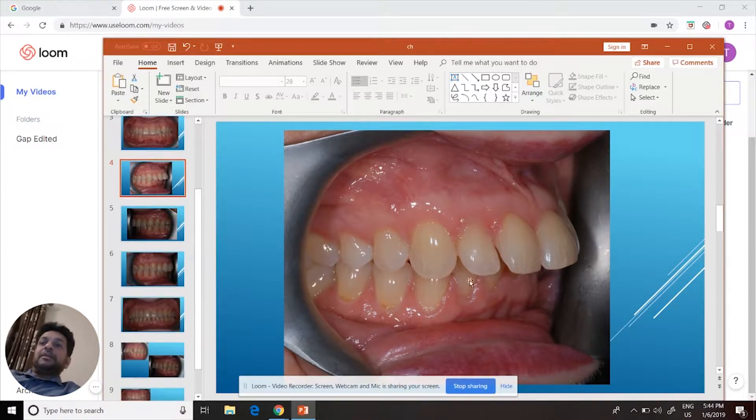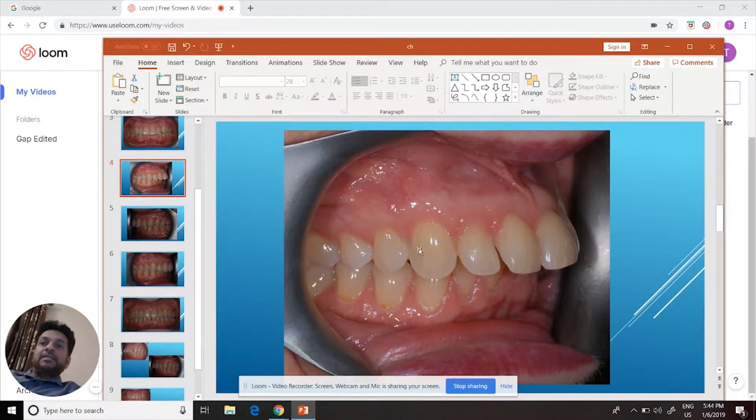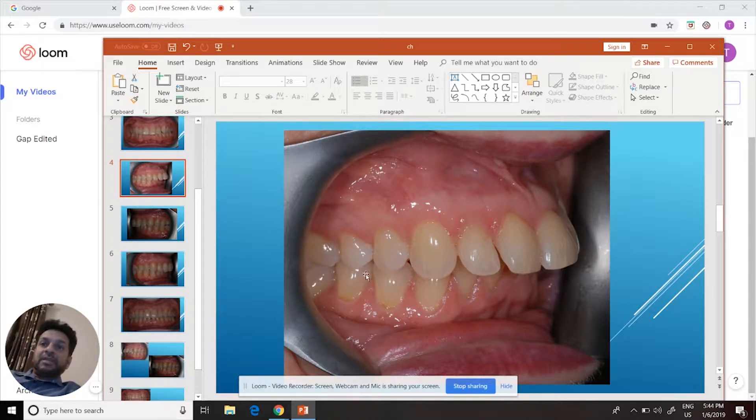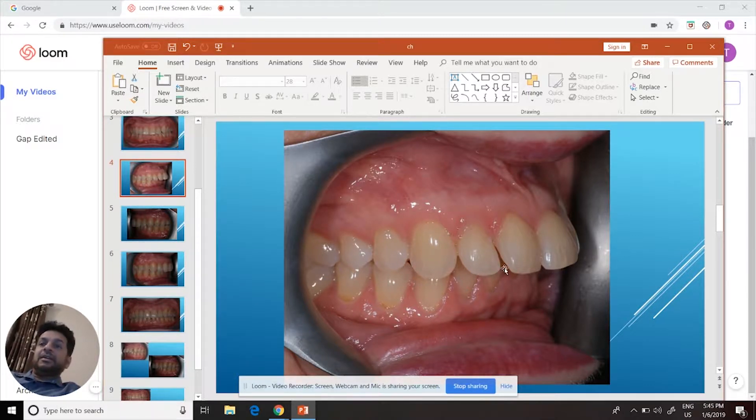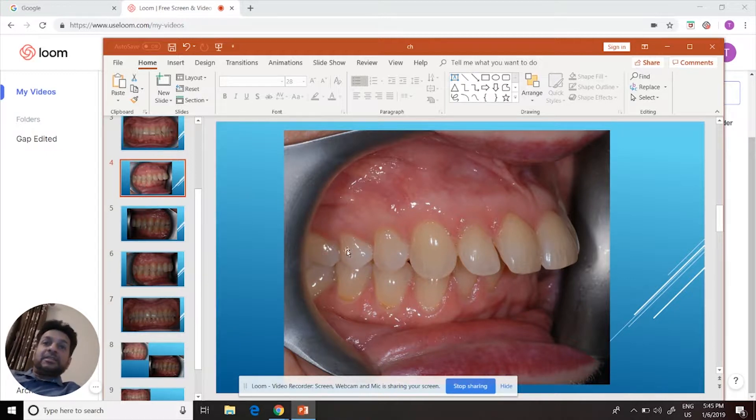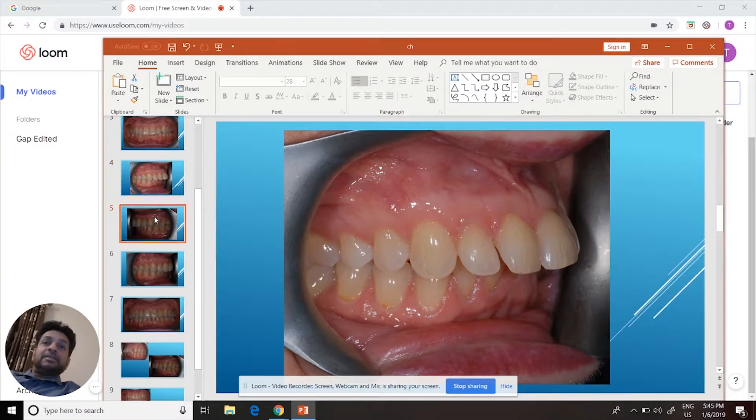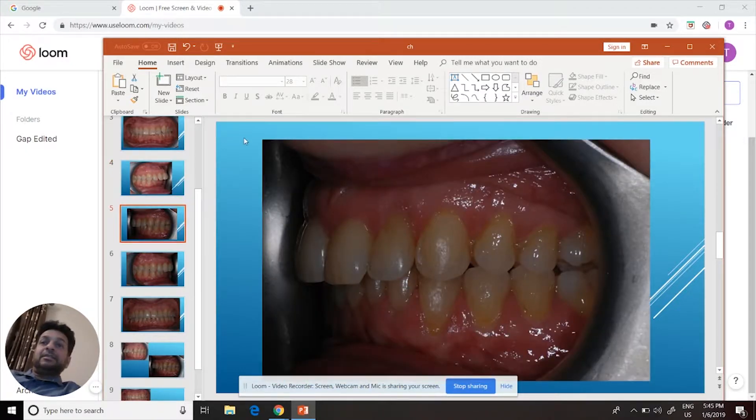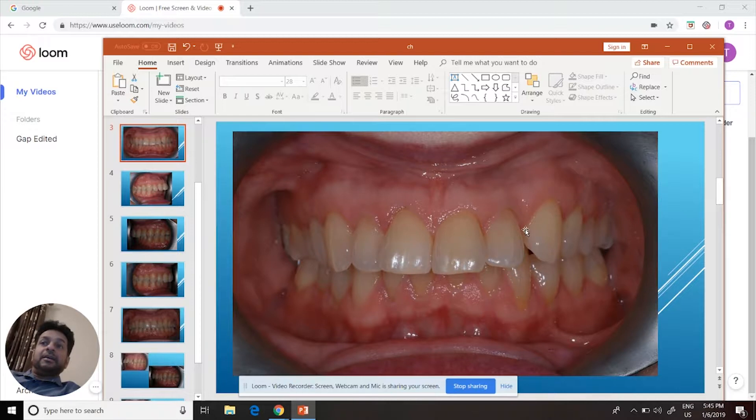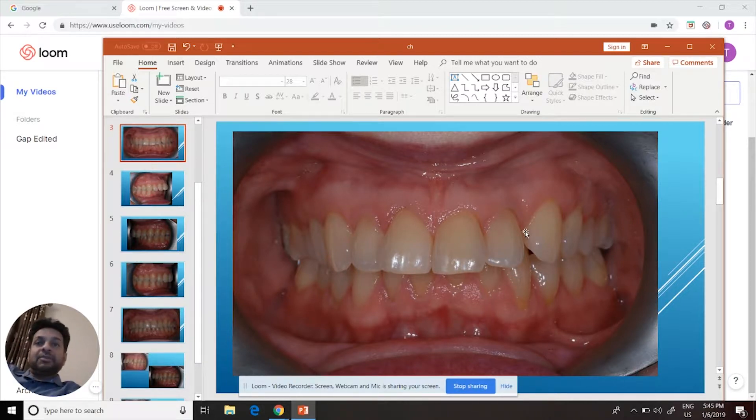We closed it by creating space in between the teeth on the right side, so we created the space here. Then we used that space I created and also the space that she had from the other side to bring the upper teeth back.